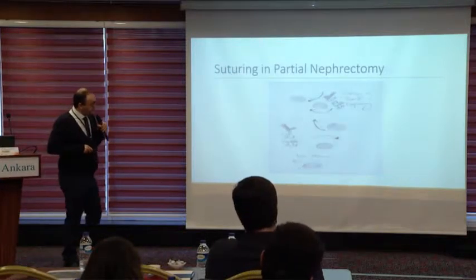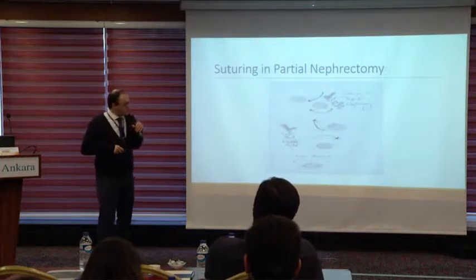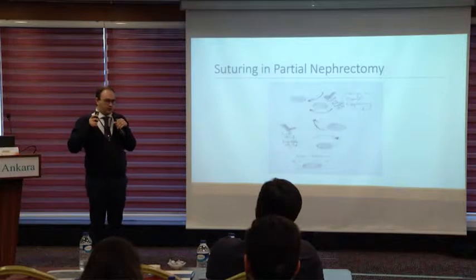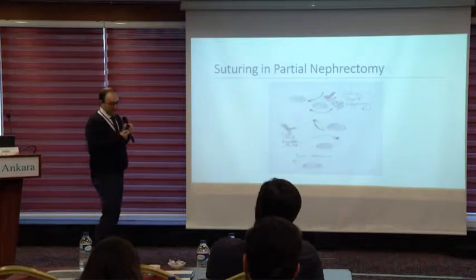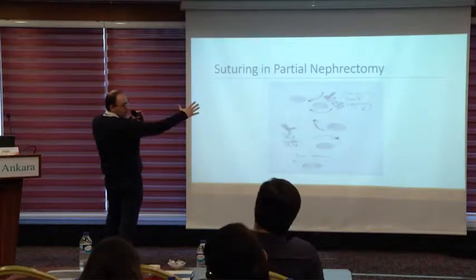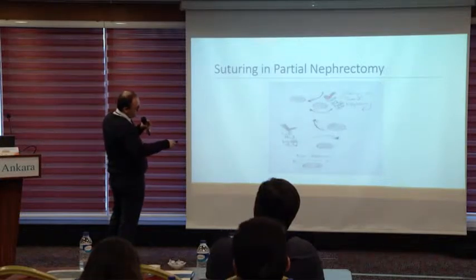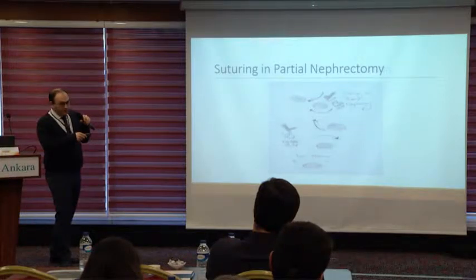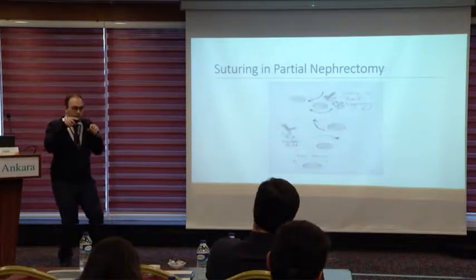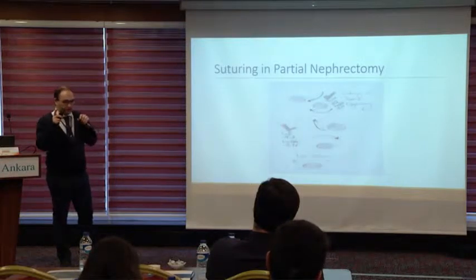Now, if we take the total movement, which improved my suturing in laparoscopy. Now, this is my hand. This is my needle holding position, as you see from here. I am holding the needle, and this is the mass. I am getting into the mass. So my net movement has 2 dimensions.